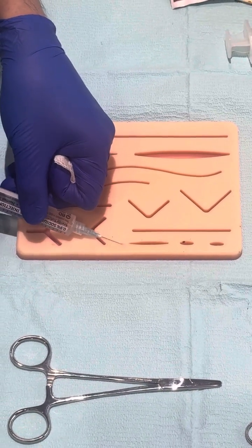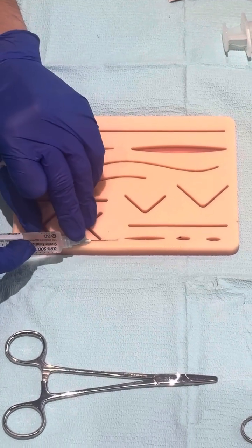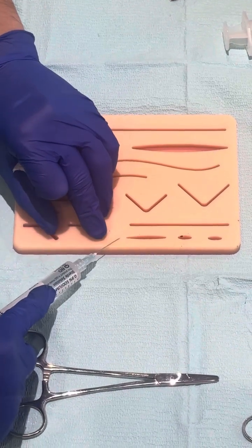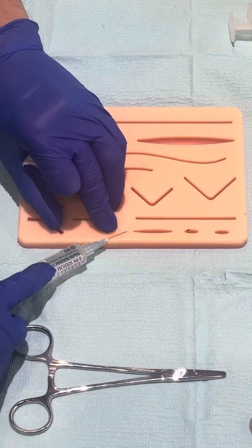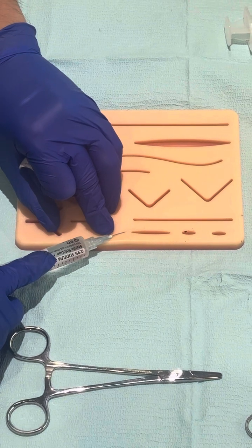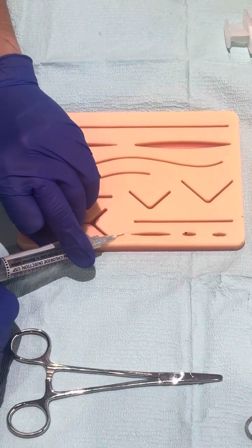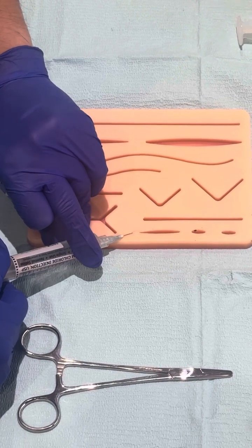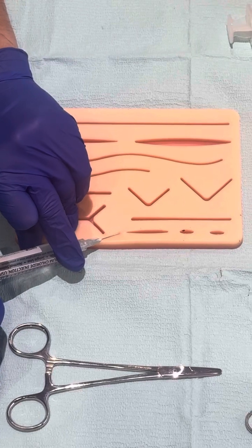After that, you can also go to the other side. At the same area where you inserted the first one, you can go over on this side, still in a diamond shape, and introduce the needle. As you withdraw the needle, you inject the anesthesia.